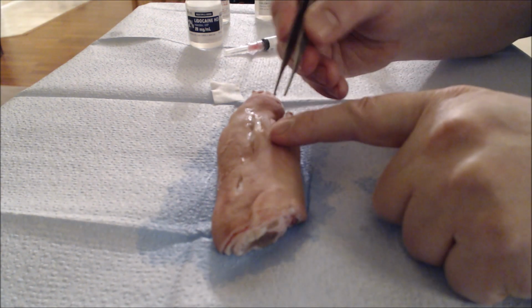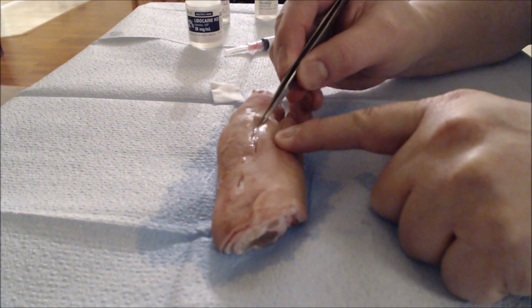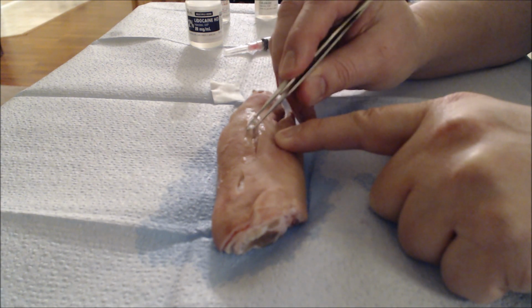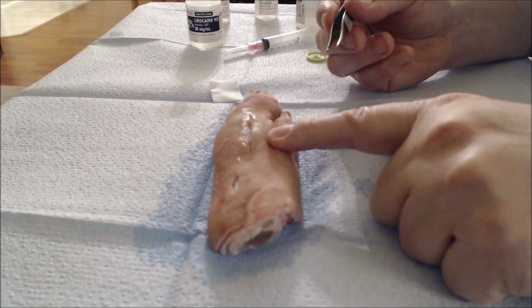If we use lidocaine with epinephrine, we'll note that this entire area on both sides is white, and it will also be numb when we test it. Once it's numb, once it's white, you're ready to start your laceration repair.